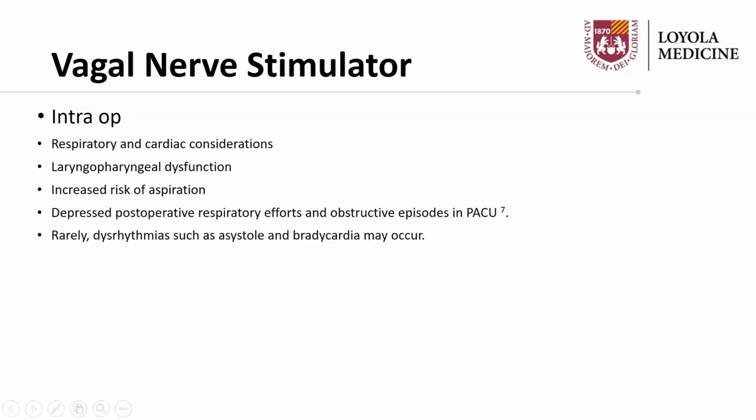So chronic vagal nerve stimulation may also depress postoperative respiratory efforts and increase the risk of obstructive airway episodes throughout the postoperative period. And although rare, like I mentioned about the AV node, dysrhythmias may occur, so these patients need a little closer monitoring.